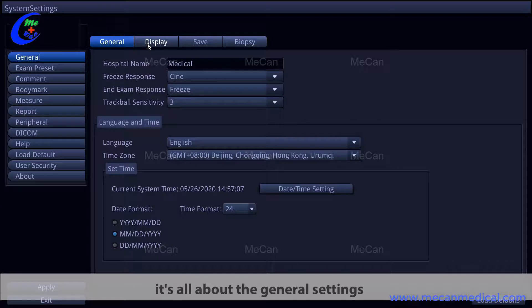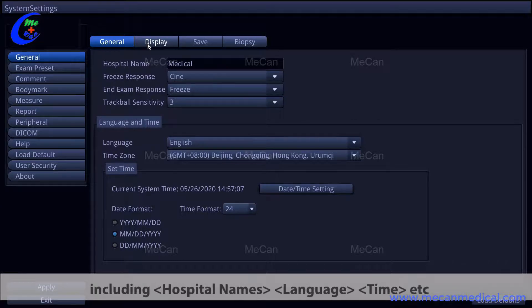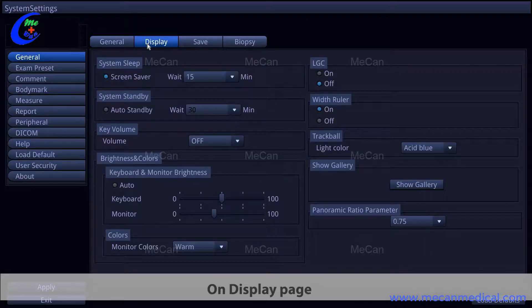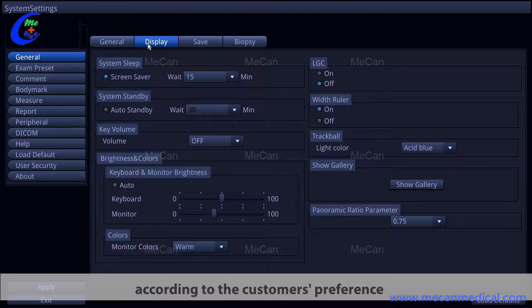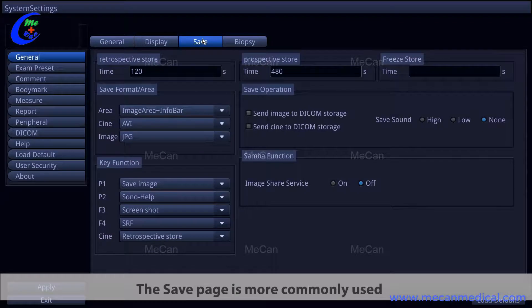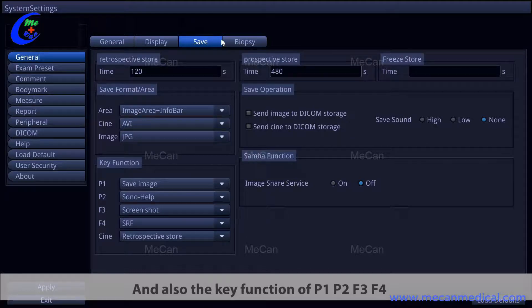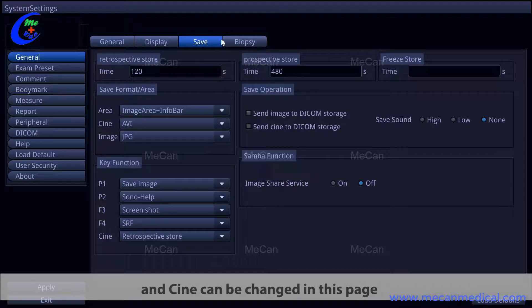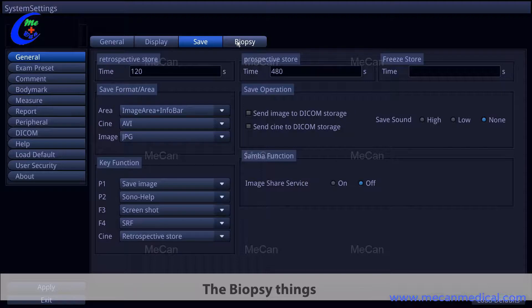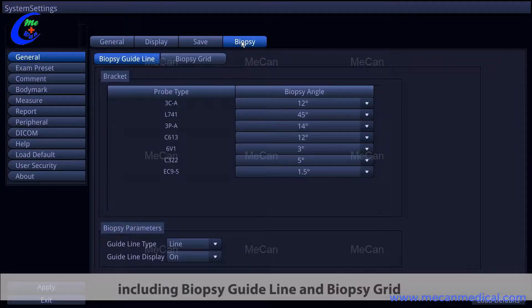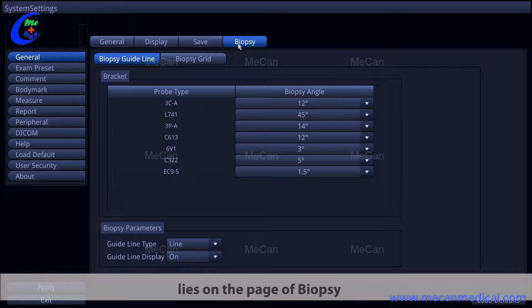On the general page, settings include hospital name, language, time, and more. On the display page, you can change display settings according to the customer's preference. The save page is commonly used because you can change the storage time and also the key functions of P1, P2, F3, F4, and Cine. The biopsy page includes biopsy guideline and biopsy grid settings.